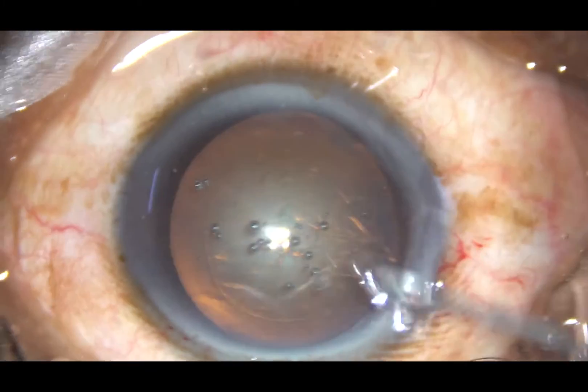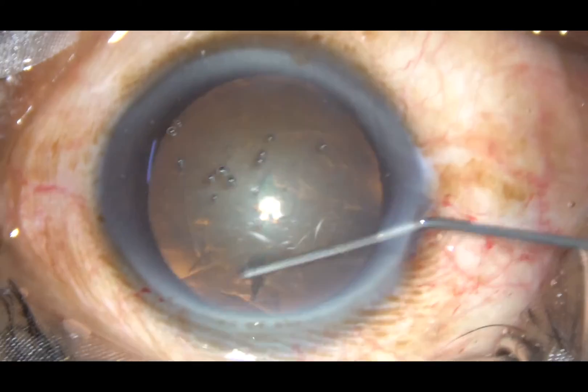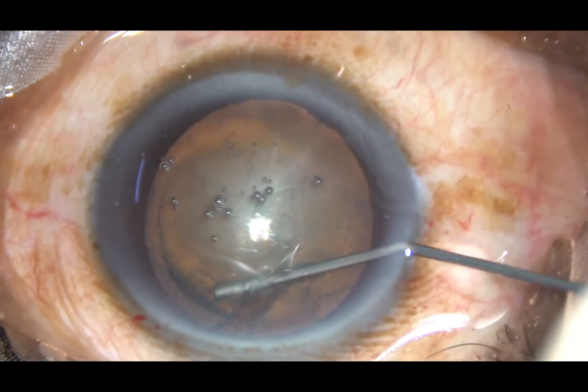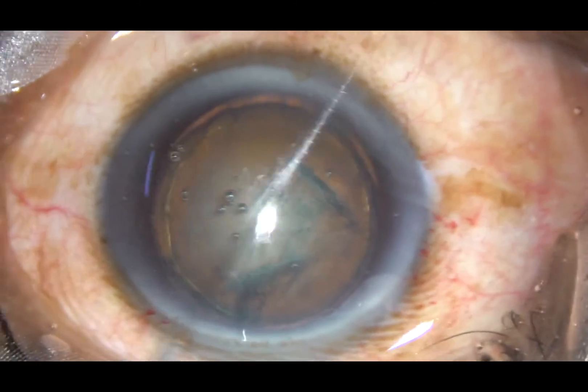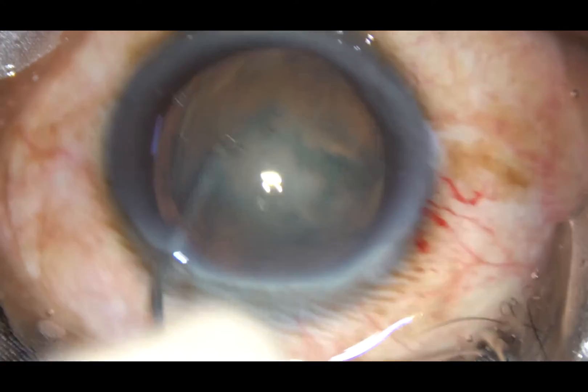Now hydrodissection and hydrodelineation are done. This is hydrodissection and this is hydrodelineation. The nucleus is then tapped and rotated.